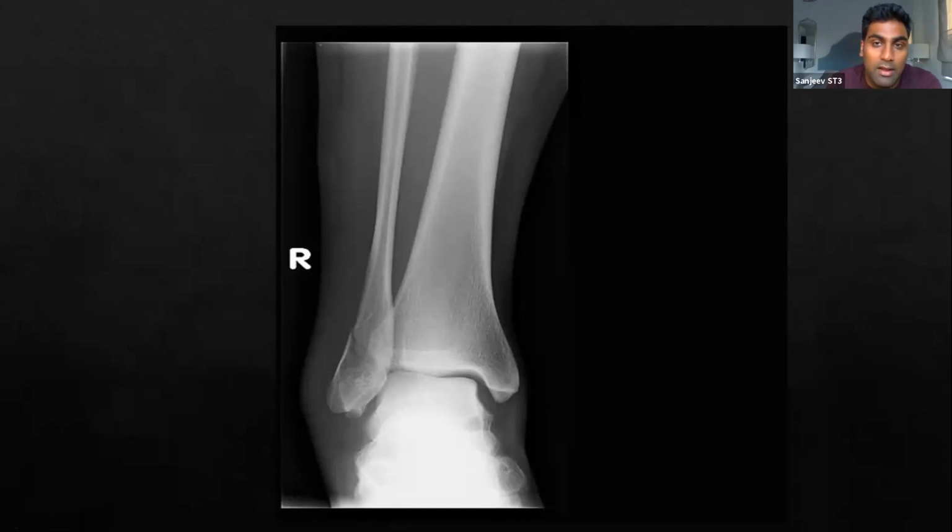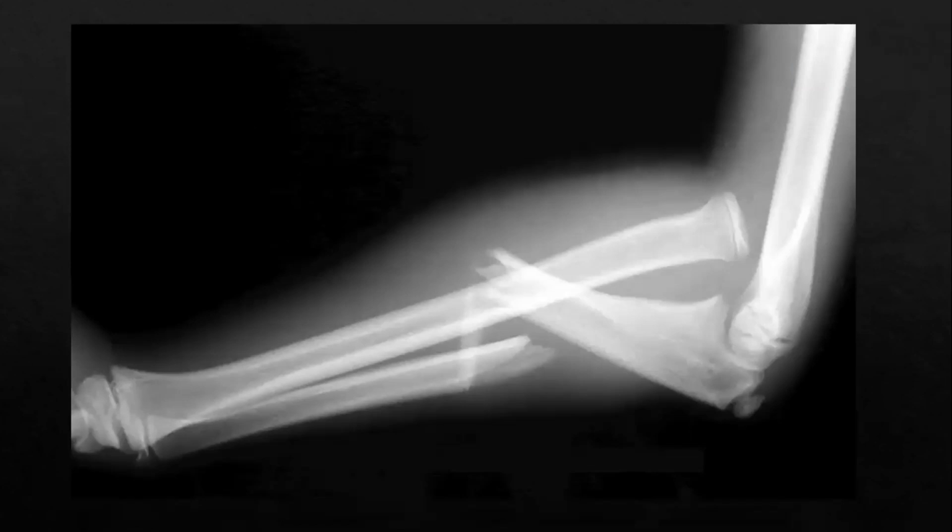So just to make sure that they have ticked off that you've checked demographic details or lack thereof. Yeah, because that will be a really, really easy tick point, and make sure you include that with any X-ray. Okay. So we just have another question.